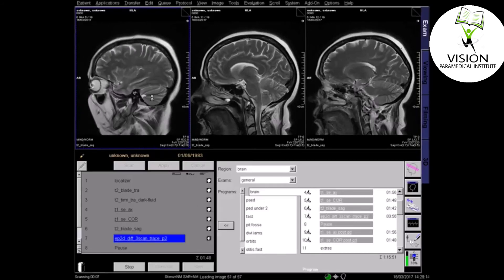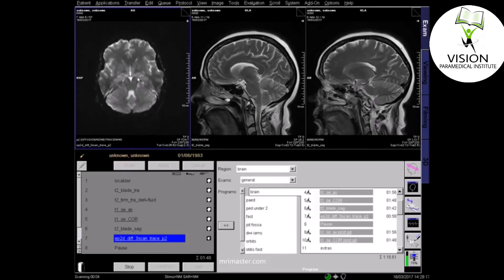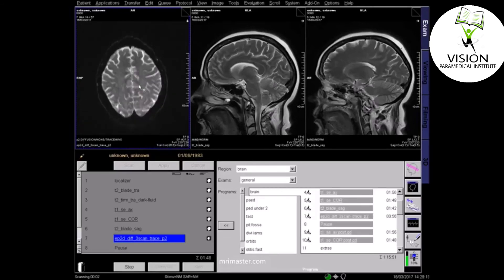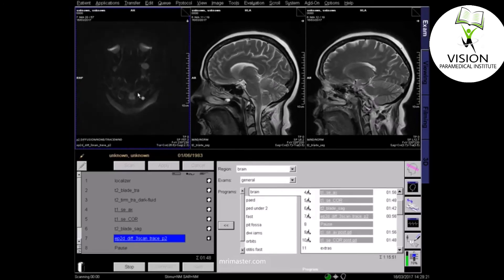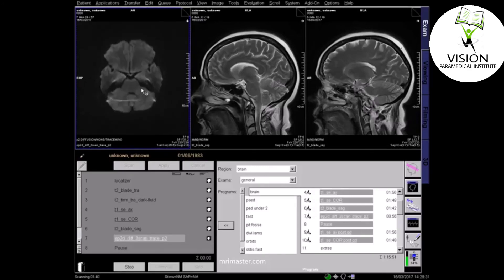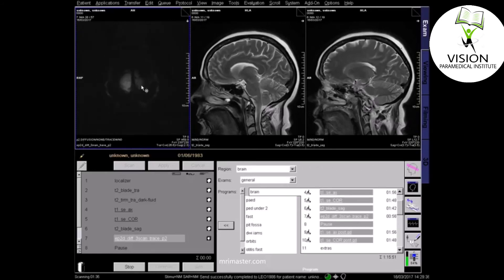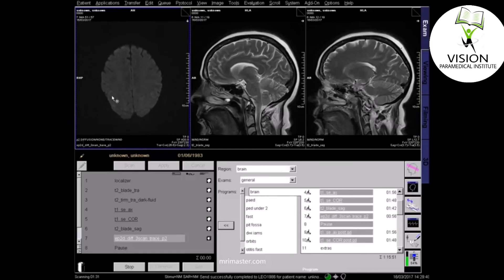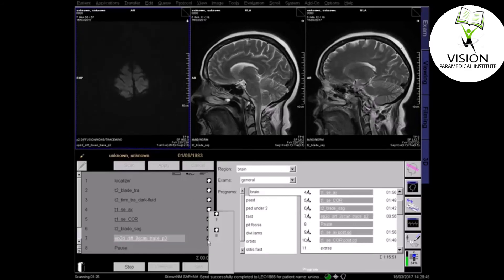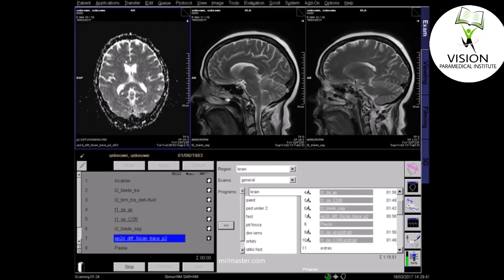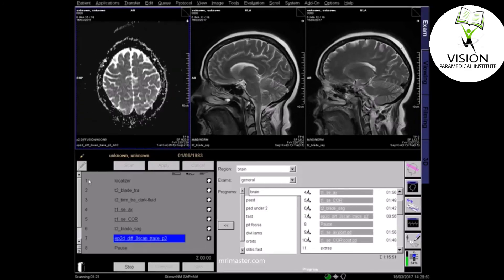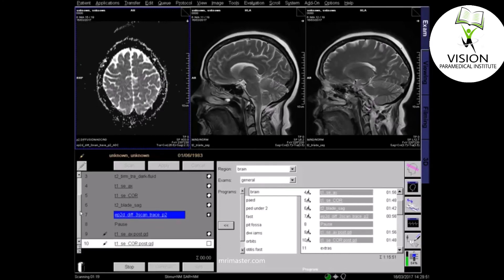The B0 diffusion scan sequence looks quite similar to a T2 because the diffusion value is 0. The B500 diffusion sequence and the B1000 sequence have progressively higher diffusion factors. At B1000, areas of restricted diffusion such as stroke will appear bright. On the ADC, or apparent diffusion coefficient map, areas of restricted diffusion appear dark.